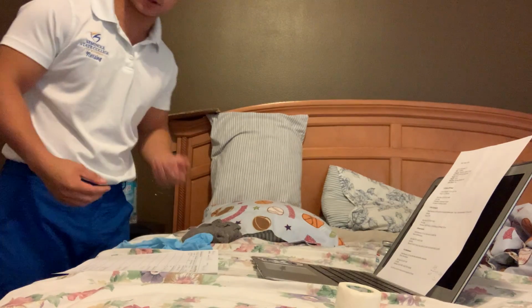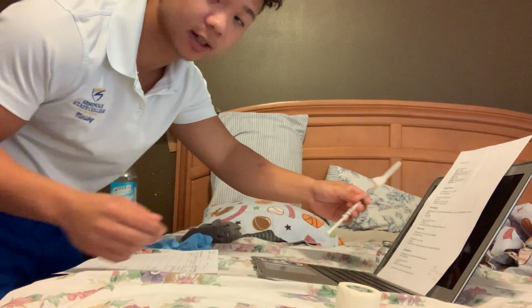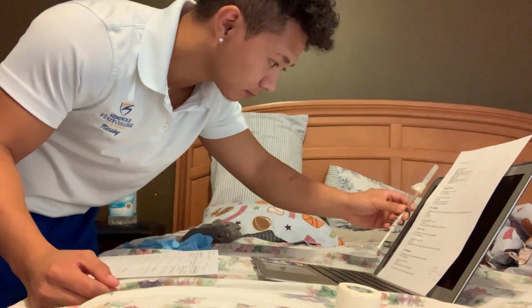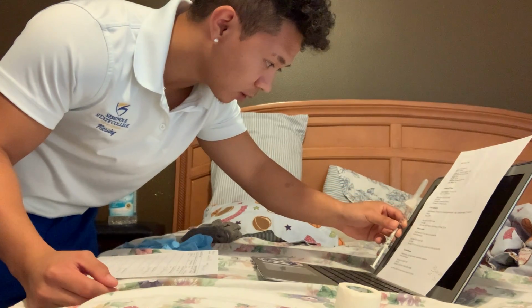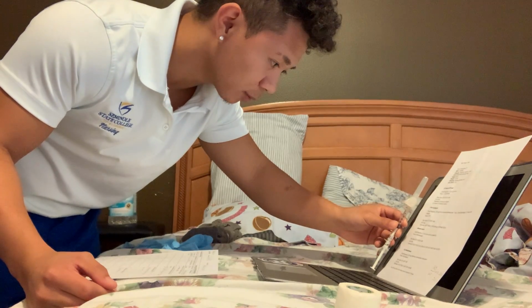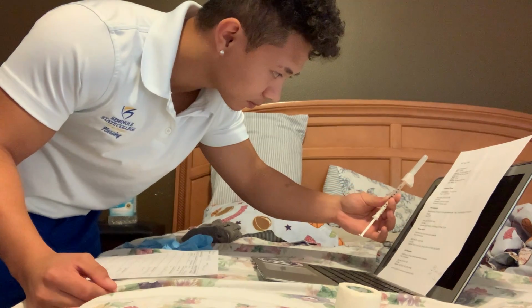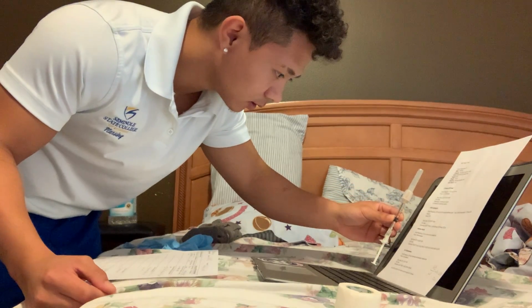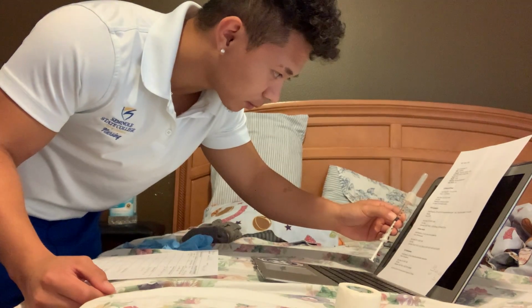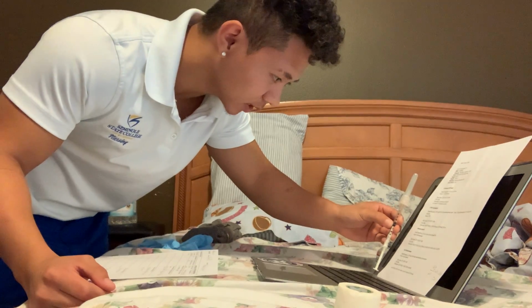And now I'm going to do my third check. So I'm going to use the syringe that I labeled. I'm going to check it against the MAR. So Anna Pawlowski, vitamin B12, 500 micrograms or 0.5 milliliters, subcutaneous route, 1458.